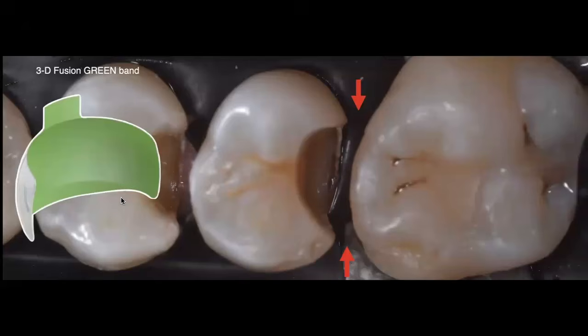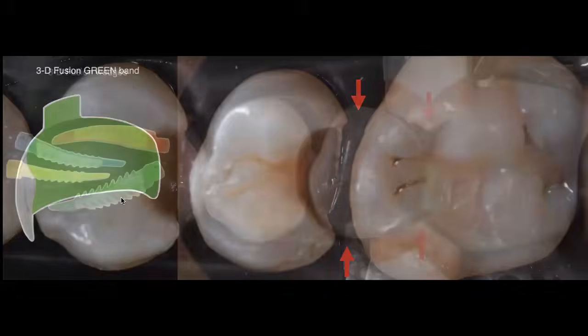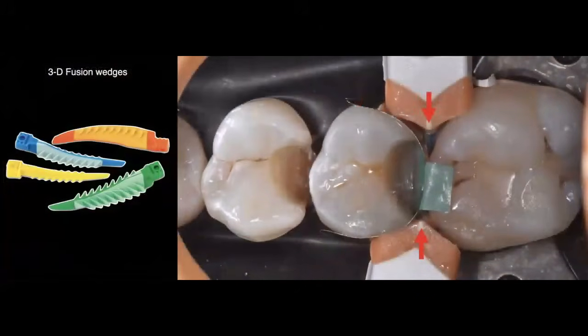And the reason why I like using these two systems, either the quad or the 3D Fusion system for these deep boxes, is because in both cases, the wedges are made out of a very soft plastic. A soft plastic that when you insert the wedge, you do not deform the band. And that's what I would recommend you use when you are using the 3D composite tight system. The band, this green band with the extension.